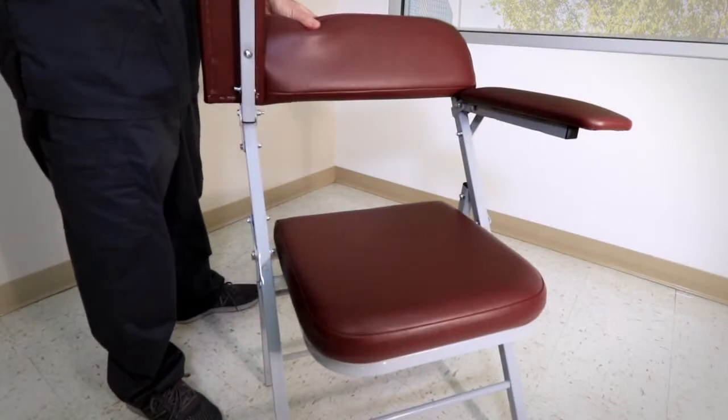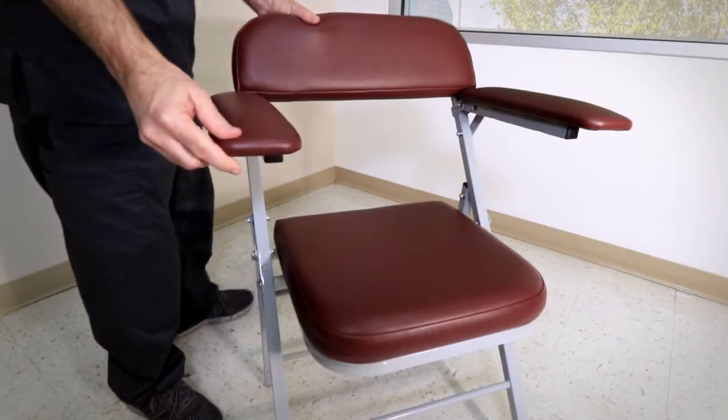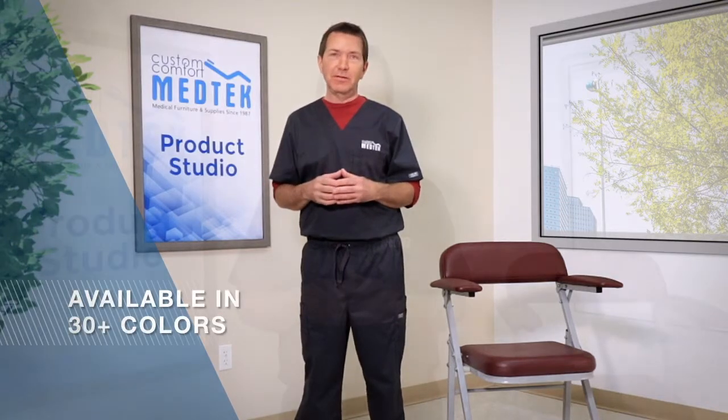One or both of the flip-up armrests can be locked into place. Overall the portable draw chair weighs just 26 pounds but can hold up to 300 pounds. It's designed for portability and comes in your choice of more than 30 colors. This chair is ideal when you're short on space or need equipment for mobile blood drives.